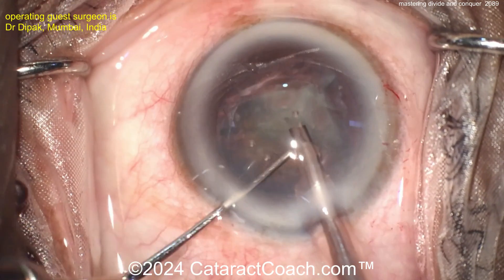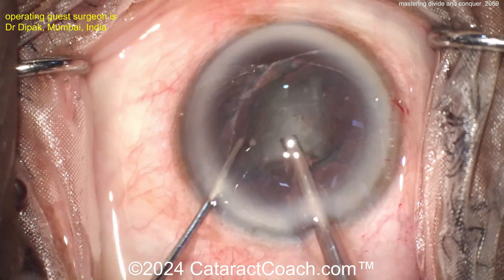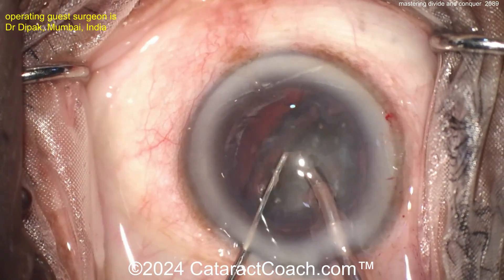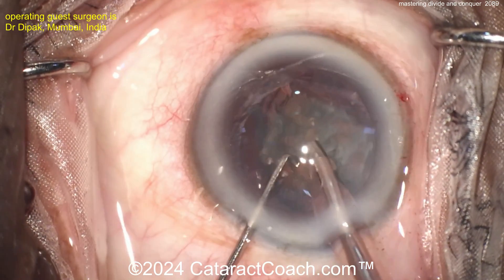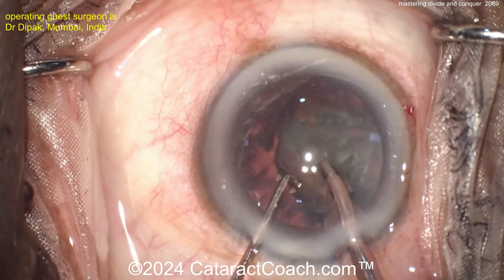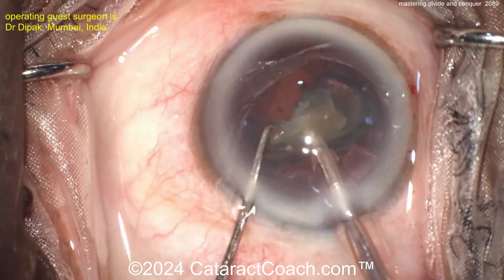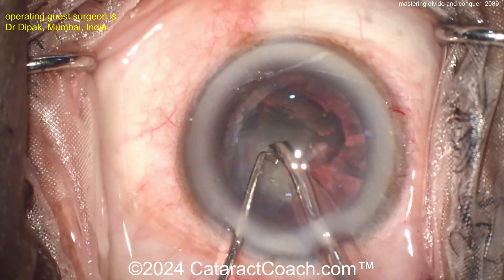Divide and conquer is a great technique — not something I use on a routine basis, but there's an advantage. Look at the surgery: how big were each of the quadrants? They weren't 25 percent, because you have to account for the amount of groove that was done. So they were a bit smaller — maybe just shy of 20 percent each. Nice, very manageable quadrants of nucleus to remove, and that can be helpful with a shallow anterior chamber or highly hyperopic patients.